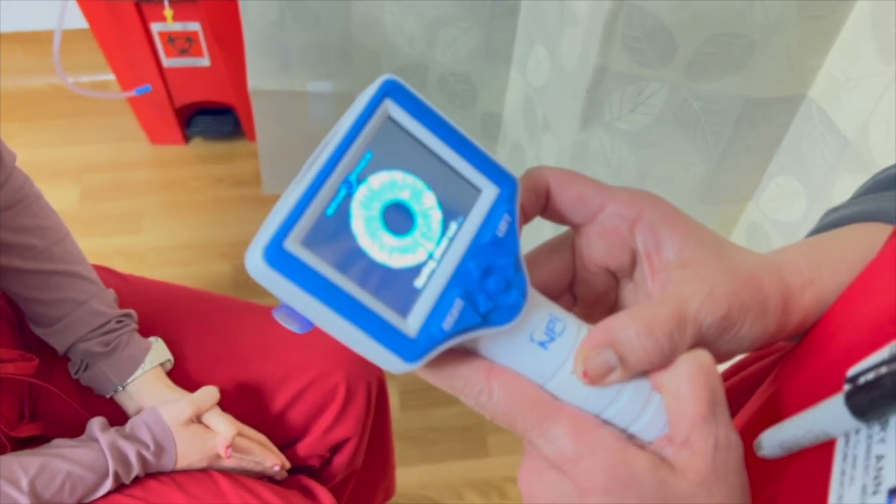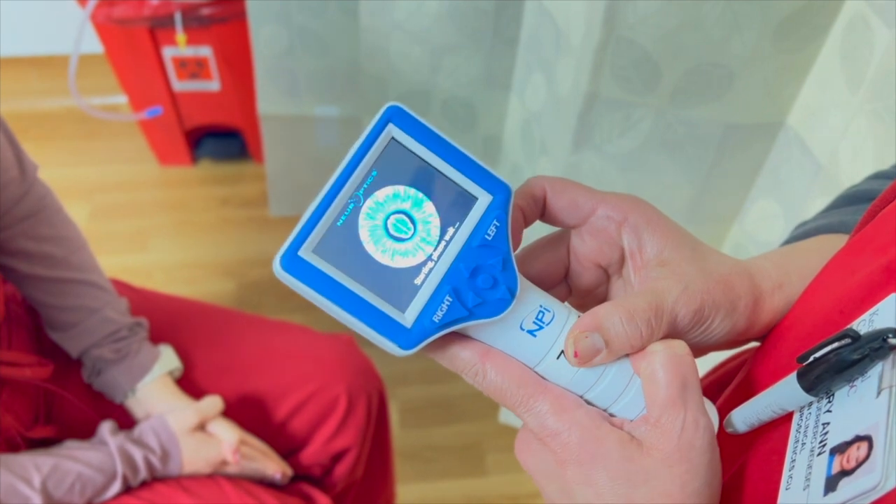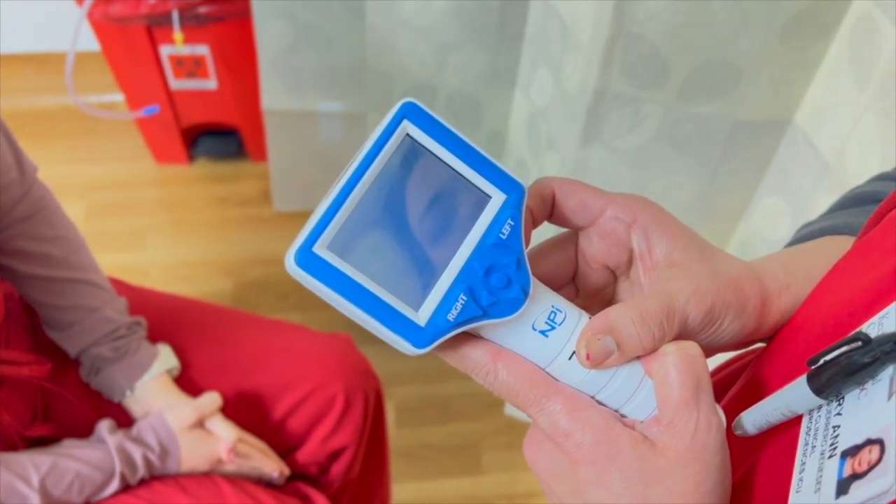Select either manual ID via keypad touch entry or scan code via the incorporated wristband barcode scanner to enter the patient ID number.